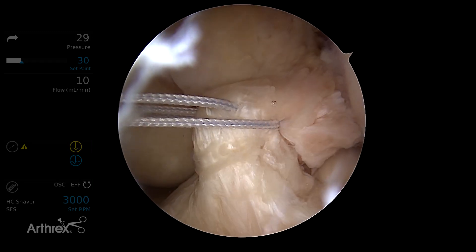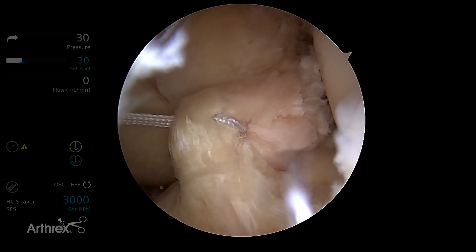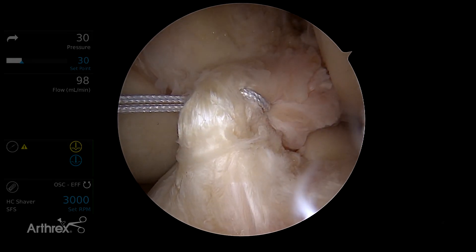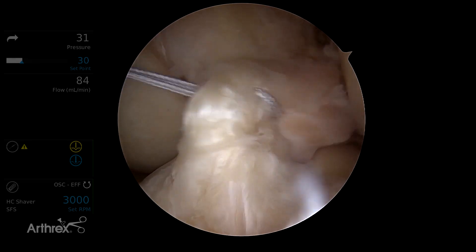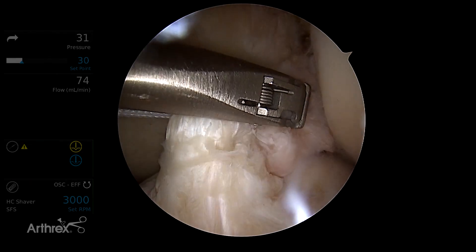As we're going up the ligament, we're creating a Bunnell-type suture pattern going up the ligament. I call it porpoising through the tissue because I try not to come through the tissue in the exact same plane each time, in order to avoid guillotining between the two bundles.